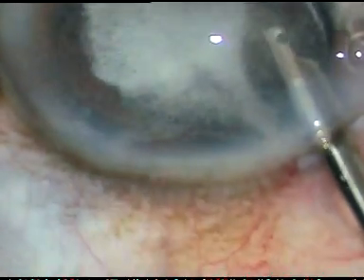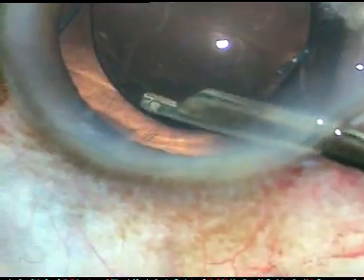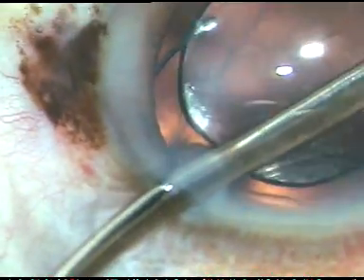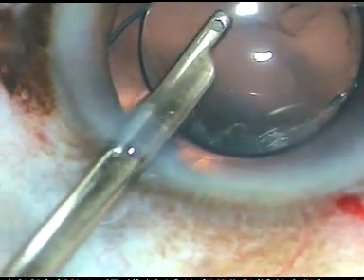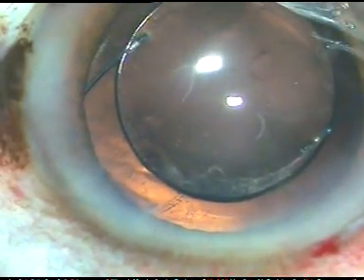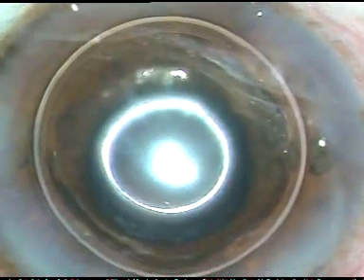And now I am going to wash it out and see if there is any vitreous in the anterior chamber or not. And yes, as I thought, there is no vitreous in the anterior chamber. Whatever little bit of Viscoat is there behind the IOL, that will get absorbed. In the anterior chamber, I may have to use some anti-glaucoma medications for a week or so. And now I have used pilocarpine to constrict the pupil. I hydrate the side port and conclude the case.